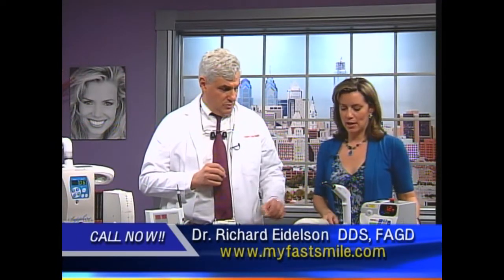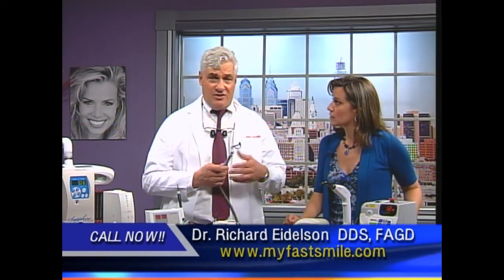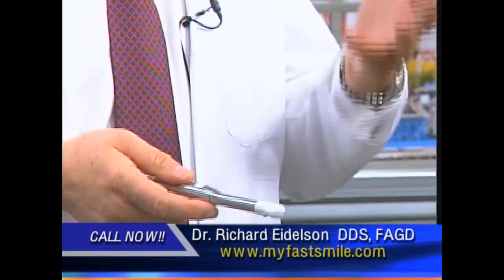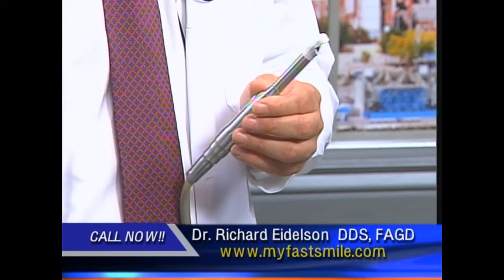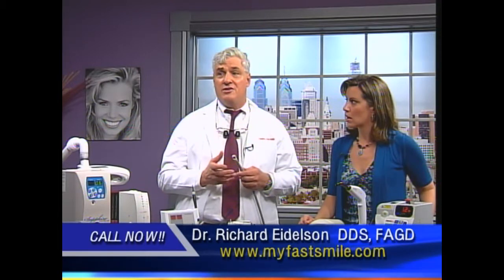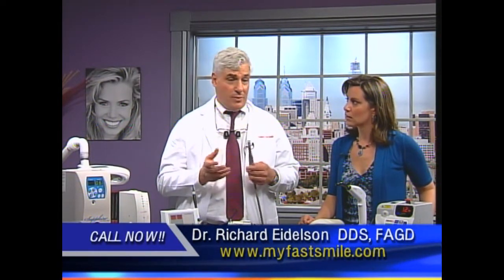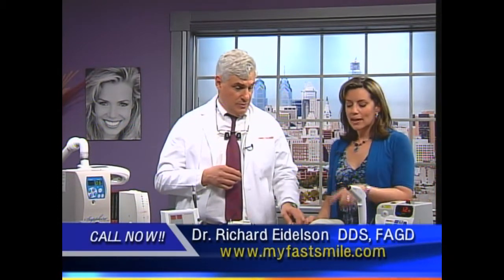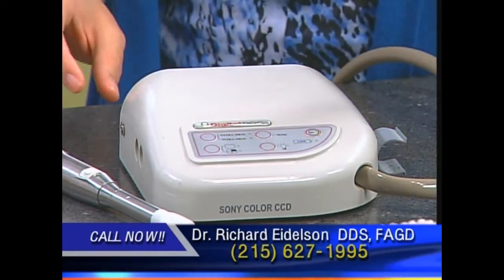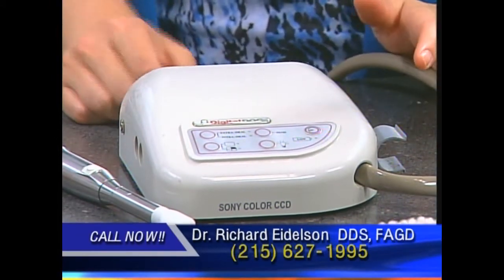Now we've got something here as well, and this also has some type of wand. Yeah, this is an intraoral camera. A lot of patients, I like to show them what I'm doing before I do it, and I put this in the mouth, and it puts the picture of their teeth up on a video screen. That's been really great for the patient understanding what we're doing and why. And a lot of times I'll show them the restoration or filling when I'm done, so they can see the dramatic change. As a layperson who's not familiar with dentistry, this would be really great for me, to sit in the chair and have you use this camera and then be able to watch right up there on the screen exactly what needs to be done. Helps with communication.